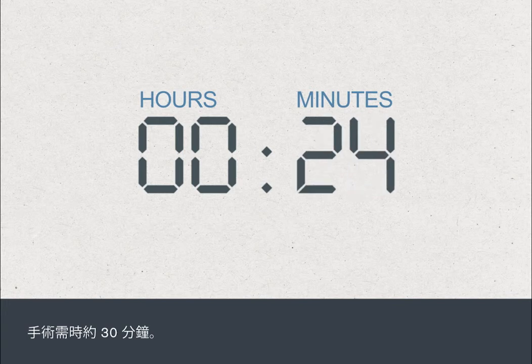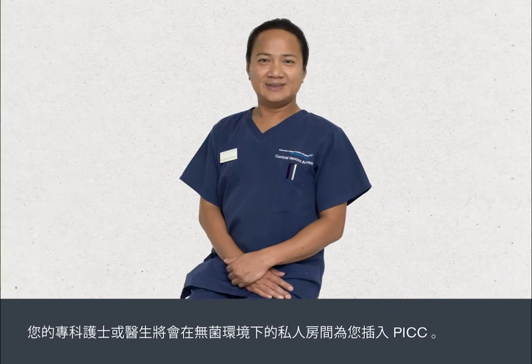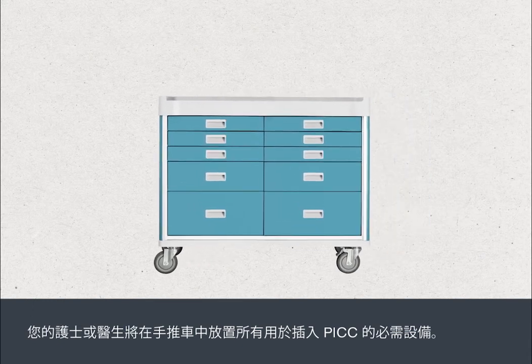The procedure takes about 30 minutes. Your PIC will be inserted by a specialist nurse or doctor in a private room under sterile conditions. The nurse or doctor will prepare a trolley with the equipment needed to insert your PIC.